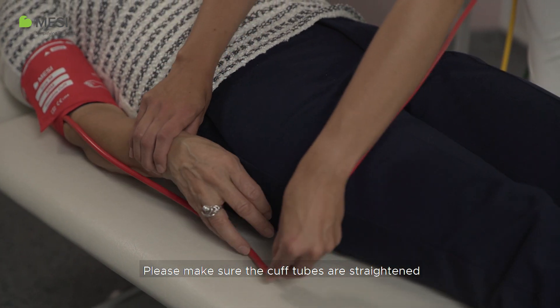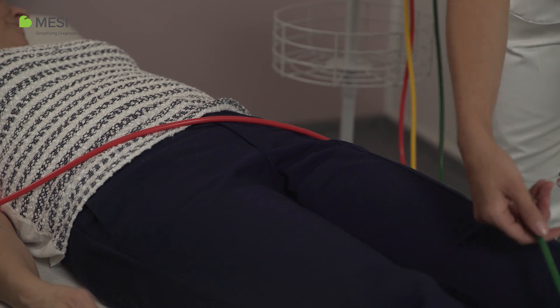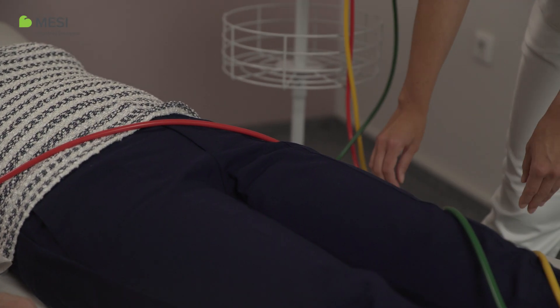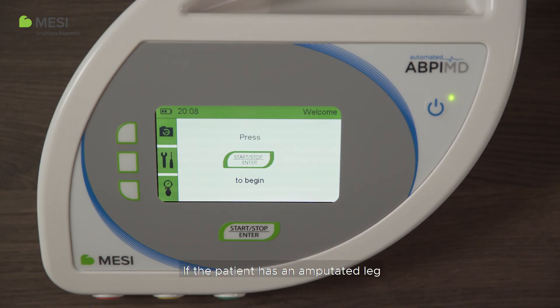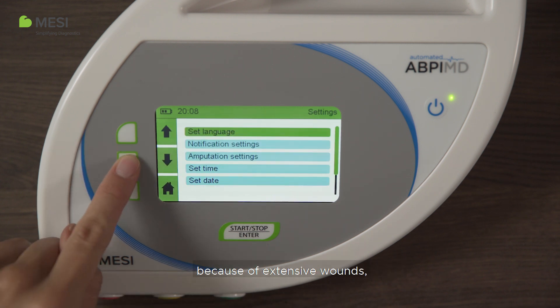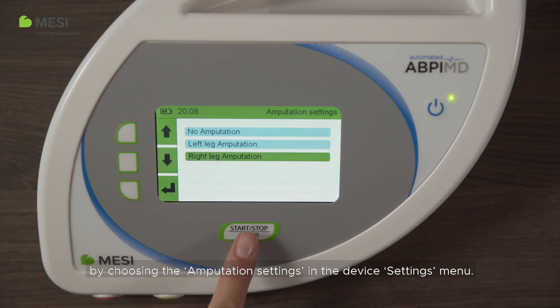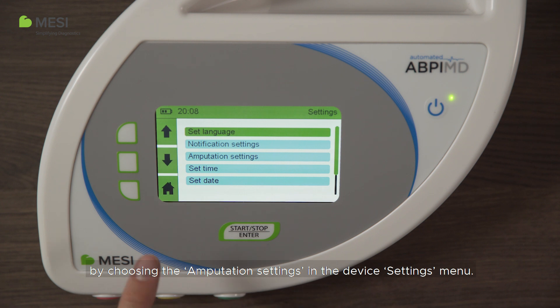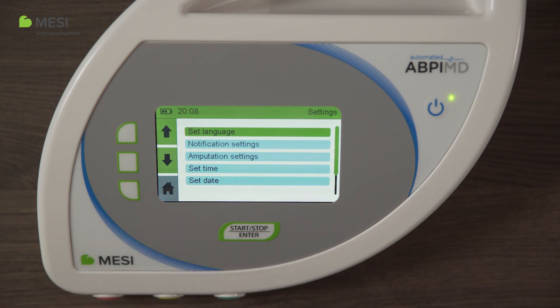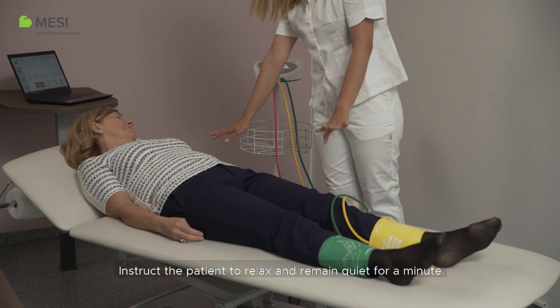Please make sure the cuff tubes are straightened and not twisted before you start the measurement. If the patient has an amputated leg or is not compliant for an ABI measurement because of extensive wounds, ABI can be measured only on the patient's left or right leg by choosing the amputation settings in the device settings menu. Instruct the patient to relax and remain quiet for a minute.